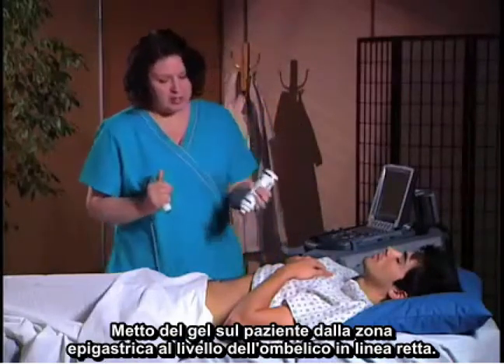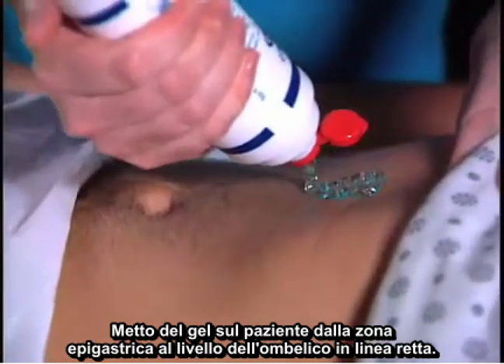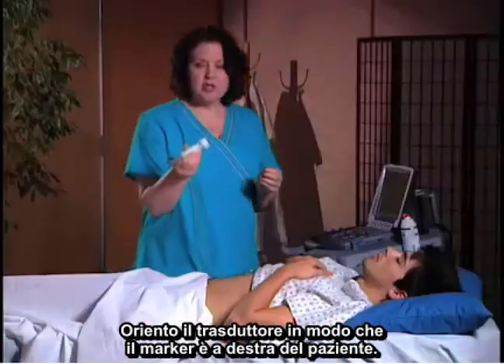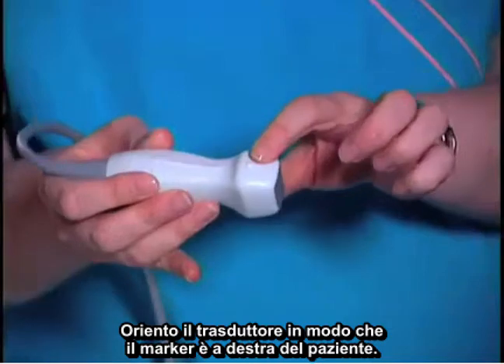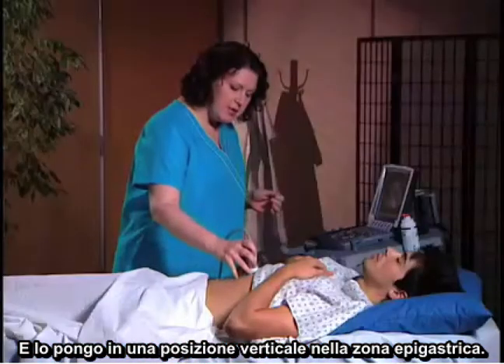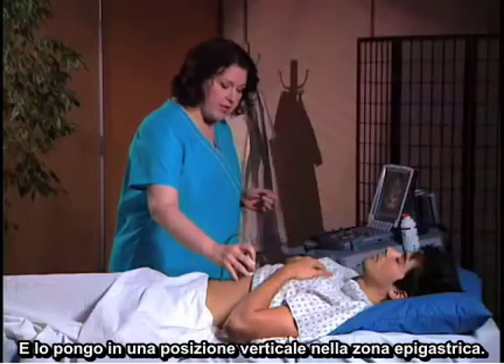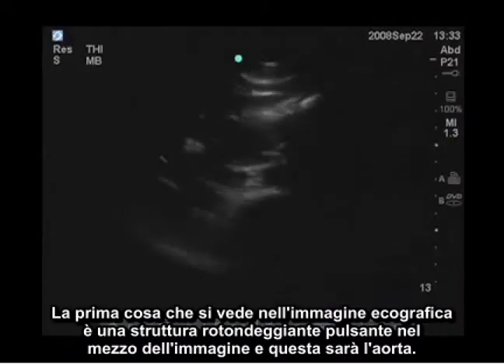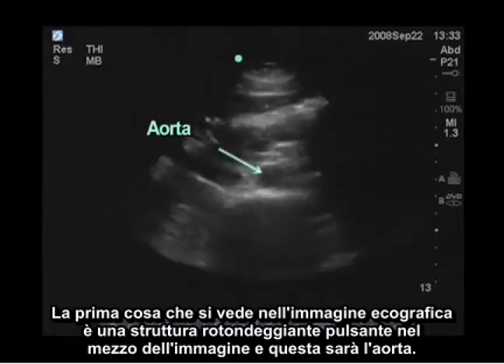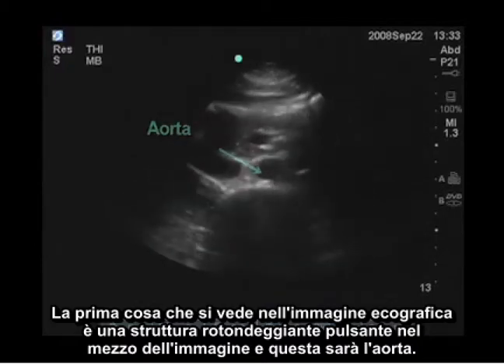I'm going to put some gel on the patient from the epigastric area to the level of the umbilicus in a straight line. I'm going to orient the transducer so the marker is to the patient's right, and I'm going to place it straight up and down in the epigastric area. The first thing that you're going to see on the ultrasound image is a round pulsating structure in the middle of the image, and this will be the aorta.